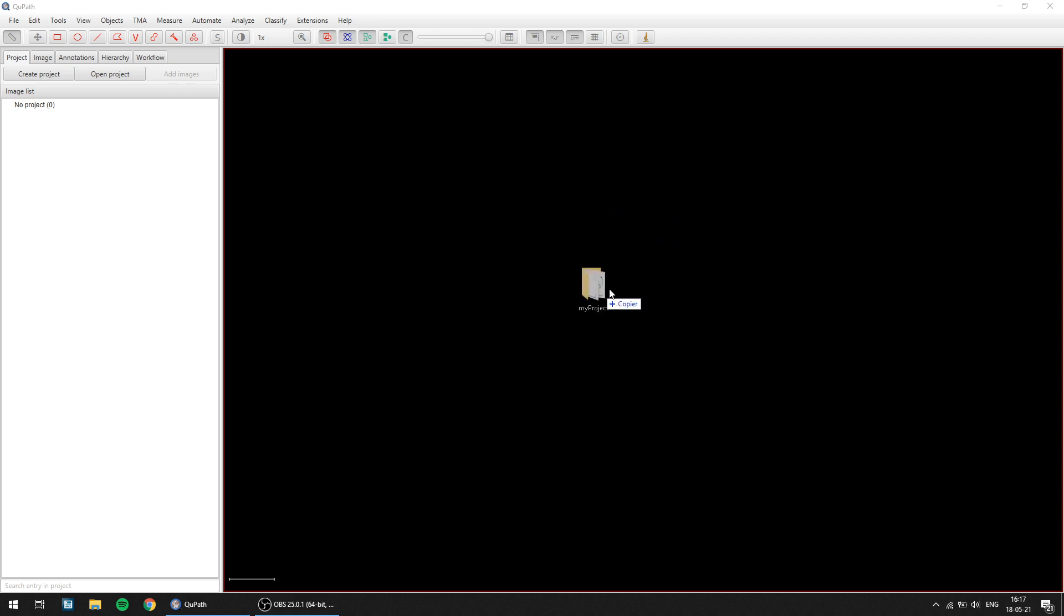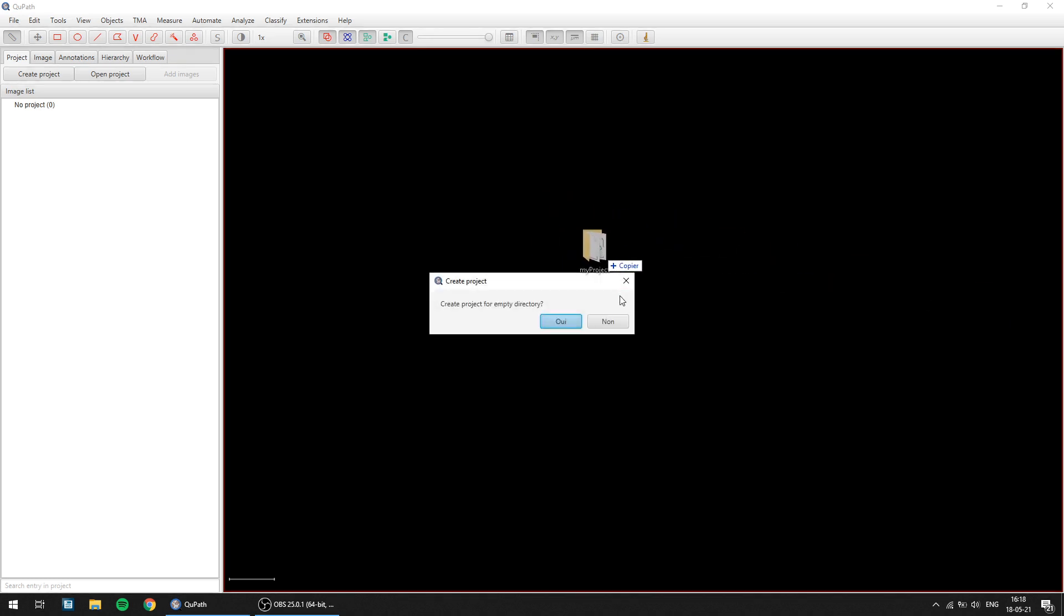So first, regardless of the task, we usually recommend creating a new project. That's why I've prepared here an empty directory that I'm going to drop onto the main viewer of QuPath, click yes and create an empty project.